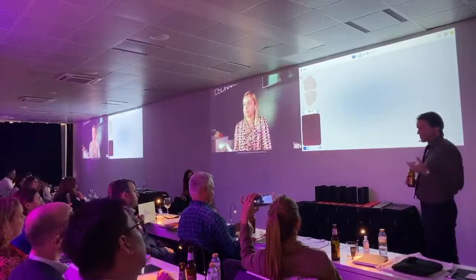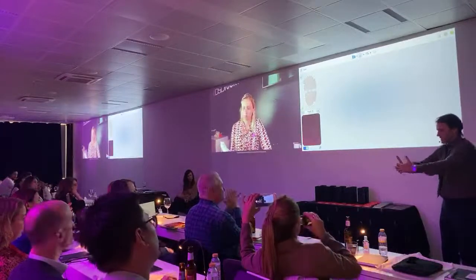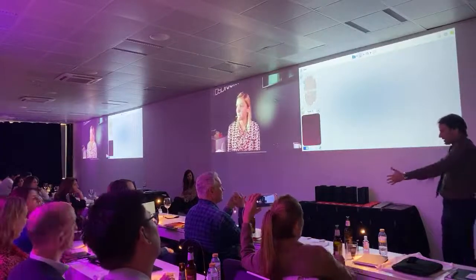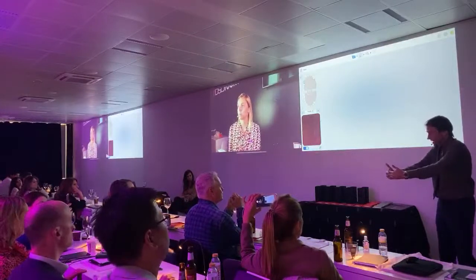The other reason to scan the palate is that you're giving extra information to the software to allow you to minimize the distortion of the arch, okay? This distortion. If you go just like a horseshoe, right? You have more of this. If you scan the palate, you're giving more information to minimize that, okay?